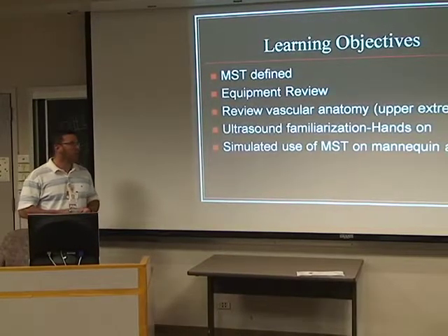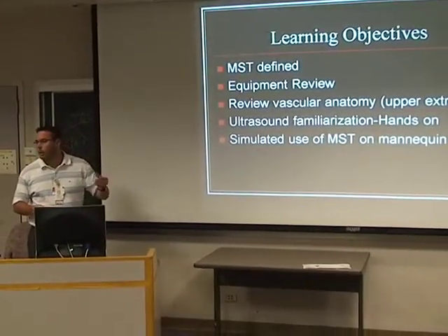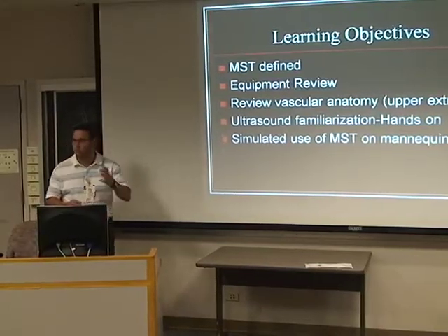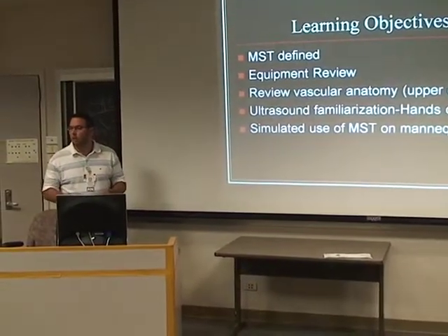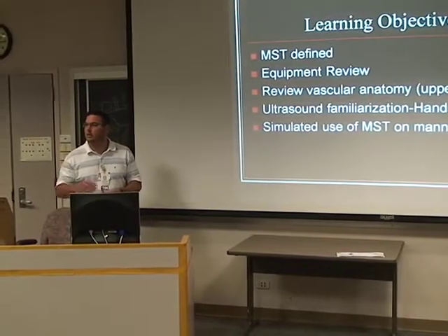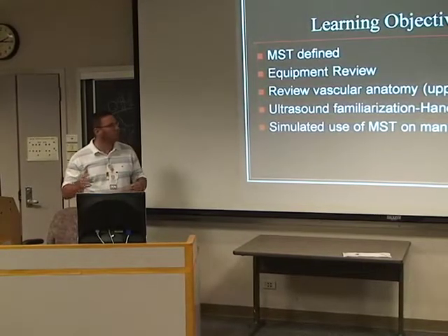And also, we'll do some ultrasound familiarization training, just on-off button, kind of how you can adjust your picture, how you actually hold the probe to view things, and we'll do all this in a hands-on fashion. And then we'll actually simulate with a mannequin arm the actual use of the ultrasound machine and the MST kit, and we'll actually get access to a vein, put a wire in the vessel, and follow that up with an introducer, which is the whole thing in a nutshell.